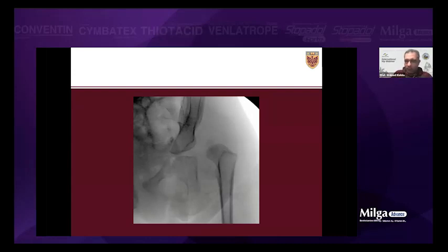After this, I will see how the reduction looks. So we get the hip into the joint, and we know the deficiency is usually anterior and lateral. So in most of these kids, I never need to do a radial incision to the labrum, Dr. Ahmed. So we do the reduction and then assess the safe range of motion, the safe zone of Ramsey, and see at what degrees the hip is going to dislocate, and the amount of adduction and also the amount of extension and flexion.